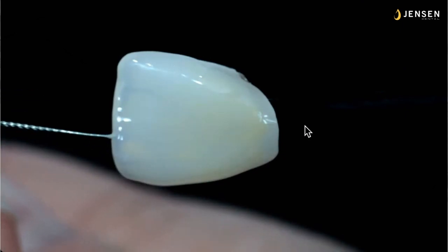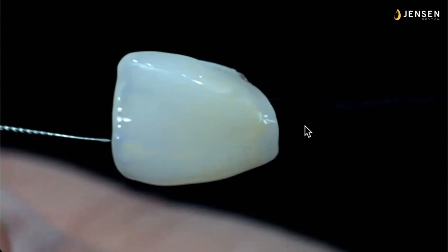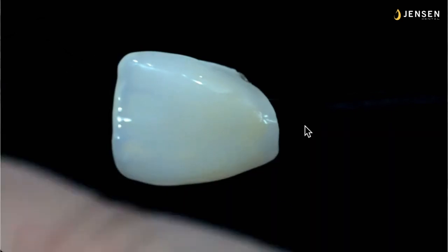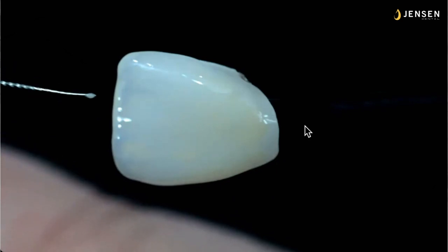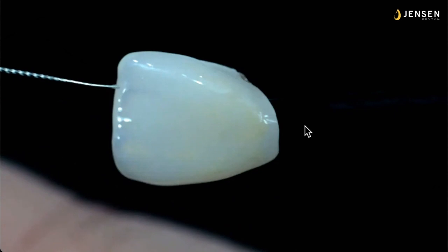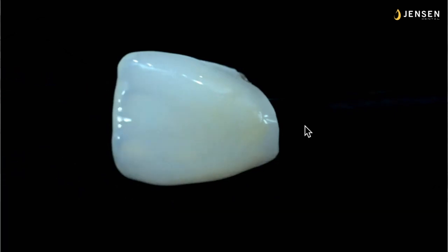Now in those blue lobe type effects, I'm using an endo file right here just to push a little bit of that spring halo. Give it a little bit more vitality right there so it looks like it's going in the lobes in between the mamelons. Real light touch.